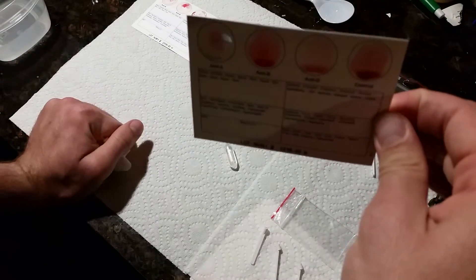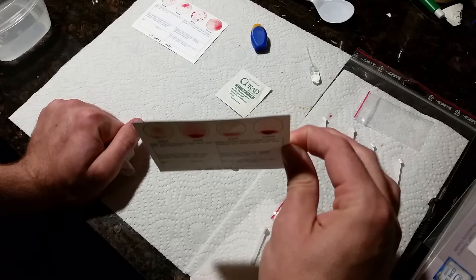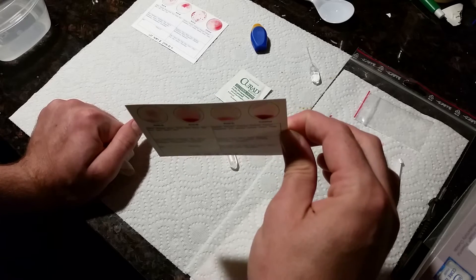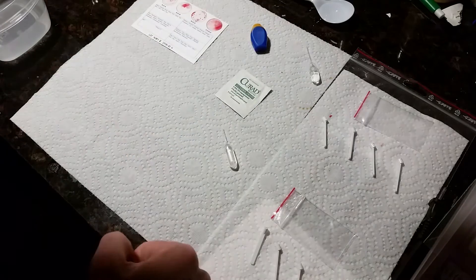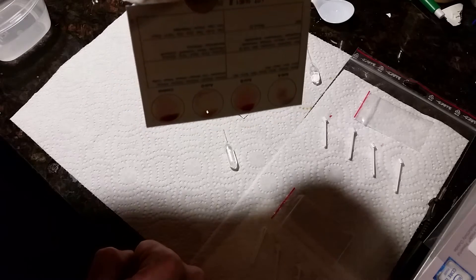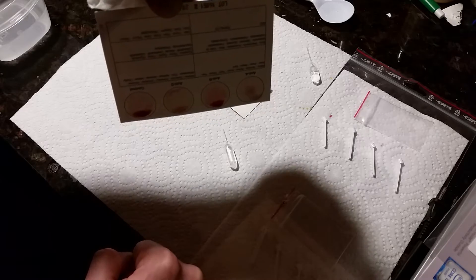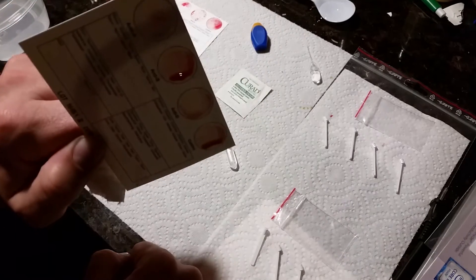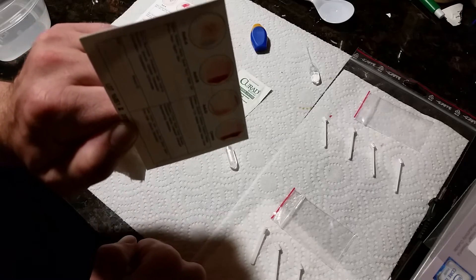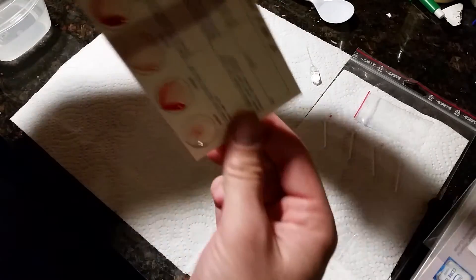Remember, you only have two minutes to do this before the blood goes bad. Now tilt the card this way for 10 seconds — this allows the granules to get left behind while the water goes down to the bottom, giving it the granulization effect. Then vertical or horizontal, six, seven, eight, nine, ten. The final position is this way — just want to make sure the blood moves around and coats each circle nicely.